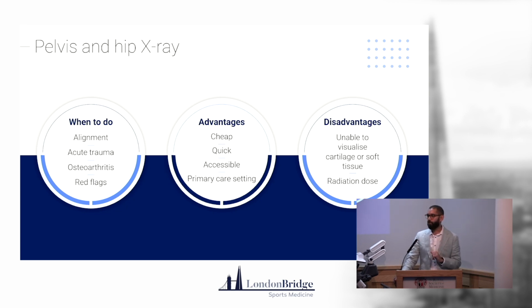I think from a red flag point of view, if a red flag scenario has crossed your mind and time is of the essence, you cannot go wrong with an X-ray. You will see bony pathology, you'll see significant soft tissue pathology as well. So really worth considering from that point of view. X-ray, very cheap, very quick, very accessible. I don't know how many of us work in the primary care setting, but really, really useful to access in that sort of setting as well.